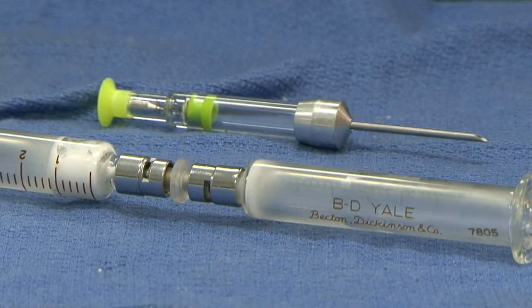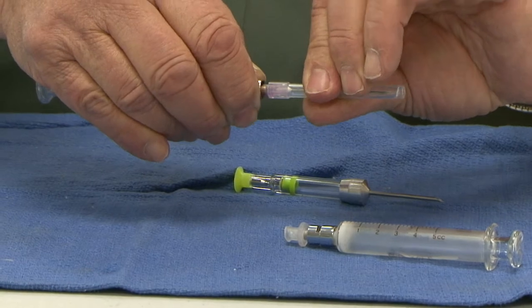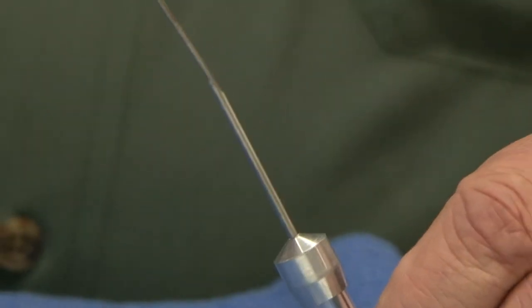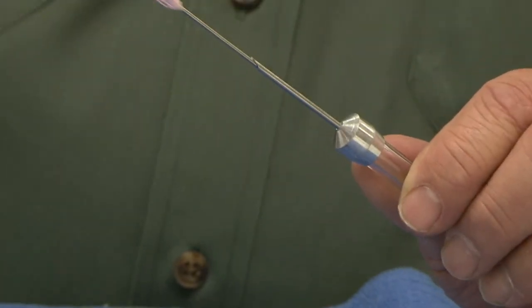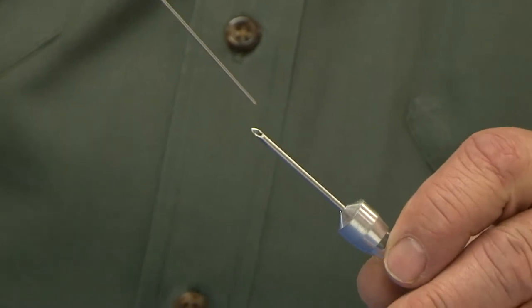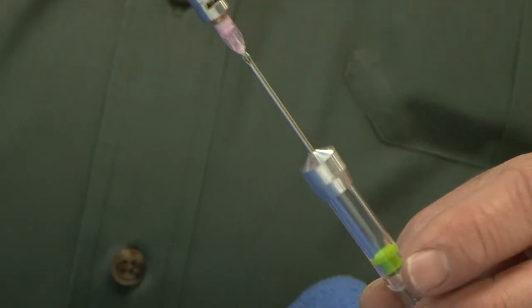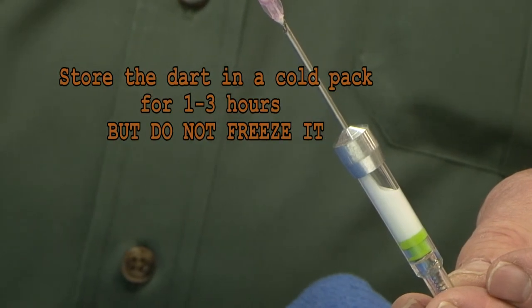If you are loading a dart, attach the 2 inch 18 gauge needle to the glass syringe with the emulsion in it. Now, holding the dart needle up, insert the 18 gauge needle on the glass syringe into the dart needle, making sure the 18 gauge needle tip is well inside the dart body. Now inject the emulsion into the dart. If the dart will not be used for an hour or more, store it on a cold pack, but do not freeze it.